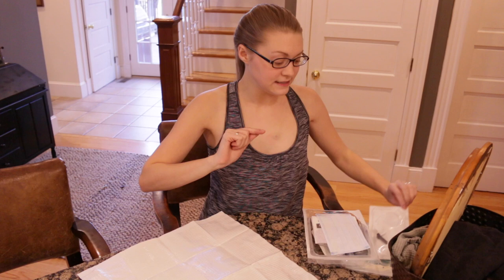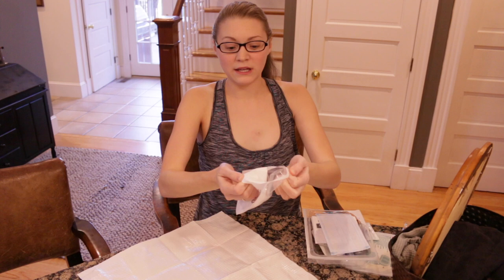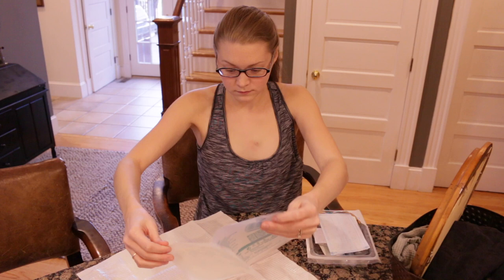Next I dump all of my items onto my sterile field without touching anything. It's good to always have extras with you in case you dump something and it rolls off. Now the syringes that come in these packages are not sterile, so I'm not going to open this one and put it on my sterile field. I'm just going to place this one to the side and we'll get there eventually. Everything else is in my dressing change kit, so here we go.